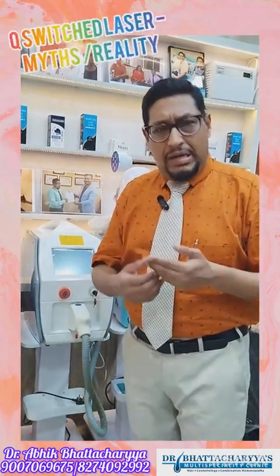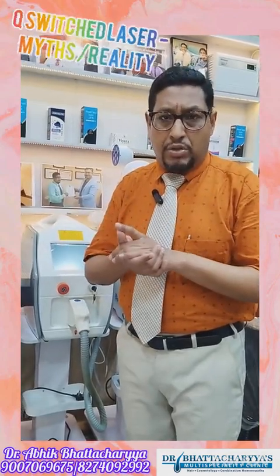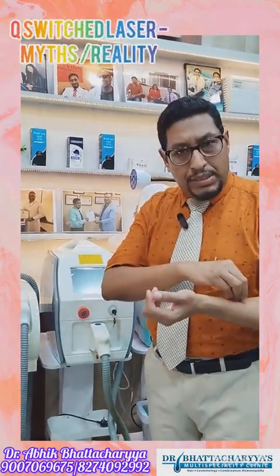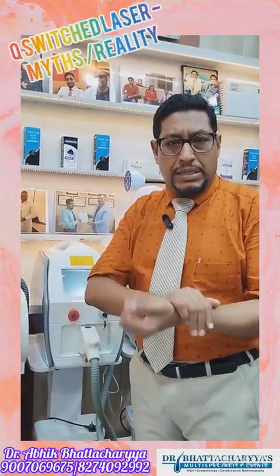There may be a ghost shadow present later on, though it may be removed in many expensive machines. That can vary, but in my machine I have seen that there may be a ghost shadow present, or it may be removed to some extent.